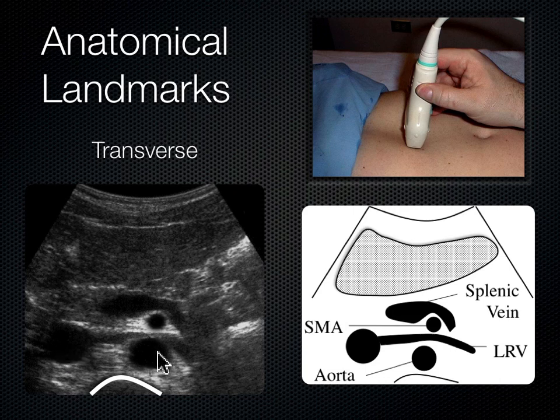Now, moving anteriorly, what vessel is this right here? It's bringing blood out to the intestines. It's a branch off the aorta. It's called the SMA, or superior mesenteric artery, and it looks like a mantle clock over here. Now realize that you guys haven't had anatomy yet. I totally appreciate that, and I know I'm kind of getting the cart before the horse, but you're going to learn it eventually. You may as well get a taste of it. This is the mantle clock, this is the superior mesenteric artery, which I think looks like a mantle clock.